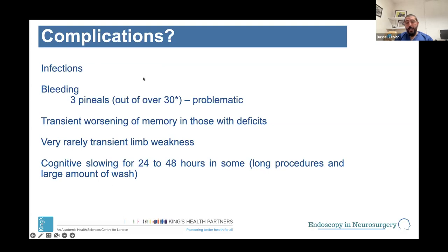Bleeding, yes, in 3 pineals out of over 30, and the majority of those had endoscopic followed by some form of microscopic surgery, except for a handful. The ones that have run into trouble have normally been over 65, and it's normally a bleed that either caused some trouble with the reticular activating system, or, in a 79-year-old gentleman, he in the end did not survive.